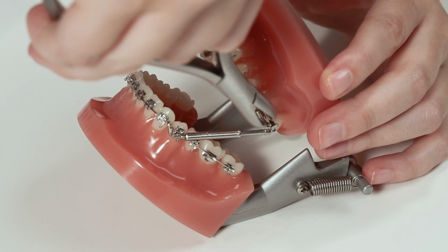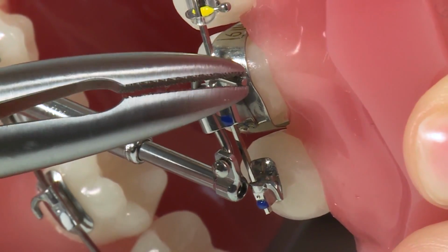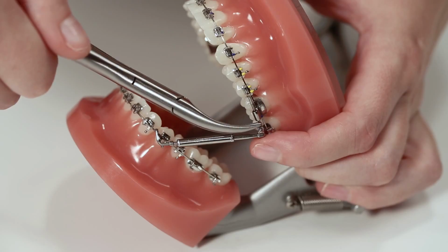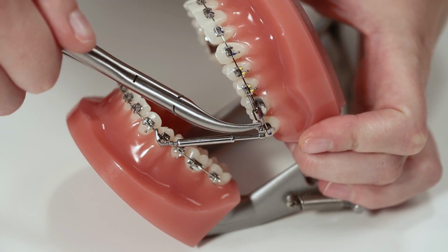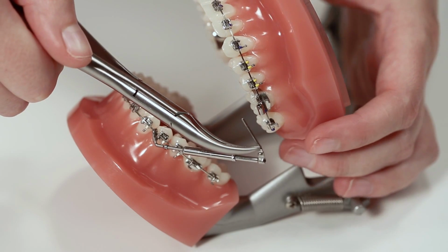To remove, bend the Euclid pin back to a straight position and then pull out of the headgear tube from the distal side. If unable to bend the pin straight, cut the pin with a hard wire cutter and ensure that no pieces fall into the patient's mouth.